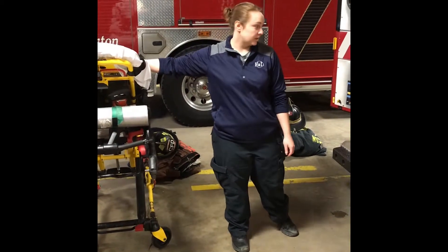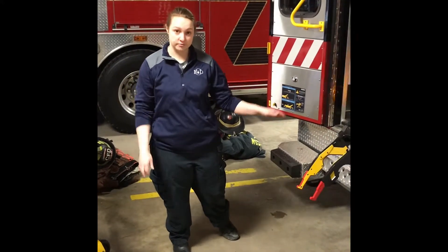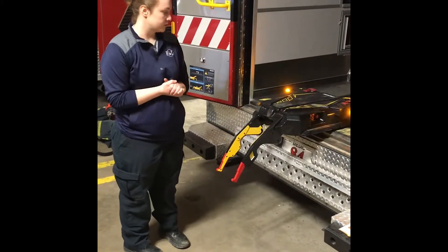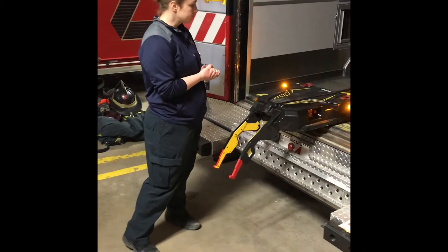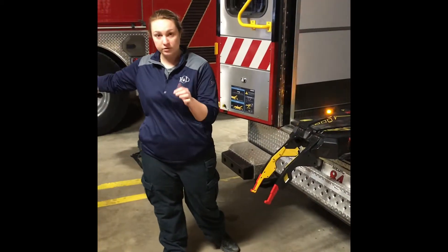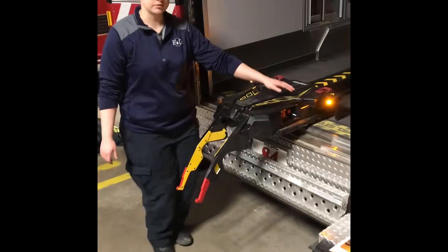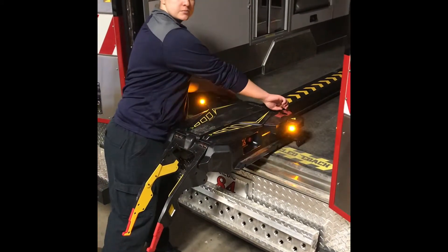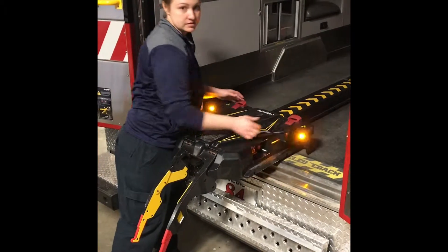Make sure all your straps are secure and not dangling underneath, because they will get tangled up in the track. For manual controls and override systems: if the controls on the cot are not working and the release control for pulling the cot out is not functioning — if these pins do not release — you have a manual control here. These red tabs: simply pull them and it will release the pins on these sides.